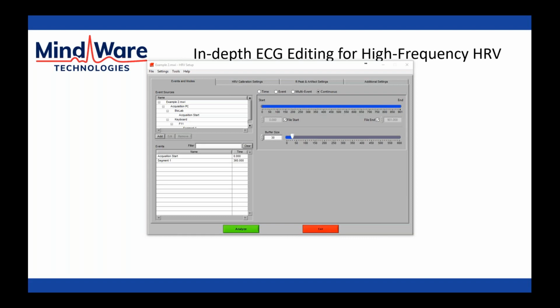All right, we have another question about the 10% rule. So just to reiterate that as well, the 10% only applies to when you have to estimate beats. If you are inserting and deleting beats that you know are either incorrect or correct, respectively, then you can do that as much as you want. It's really all about how much data are we guessing at? How much data are we estimating? And we want to make sure that that always stays below that 10% threshold.